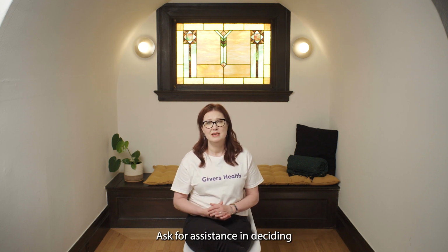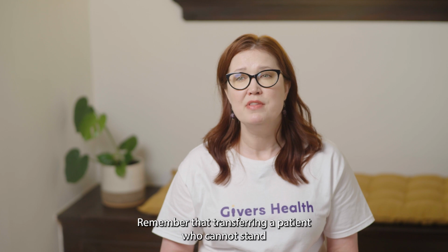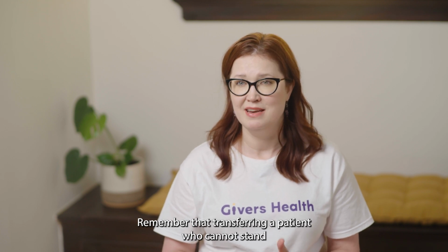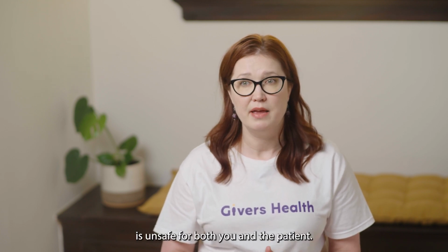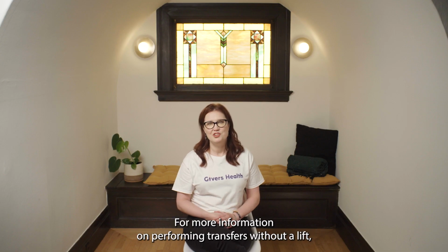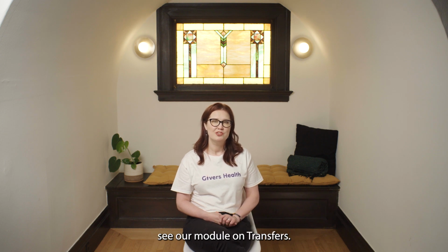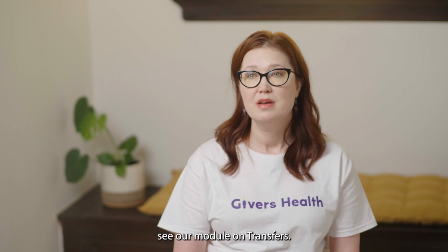Ask for assistance in deciding if a lift would be best and what kind is most appropriate. Remember that transferring a patient who cannot stand is unsafe for both you and the patient. For more information on performing transfers without a lift, see our module on transfers.